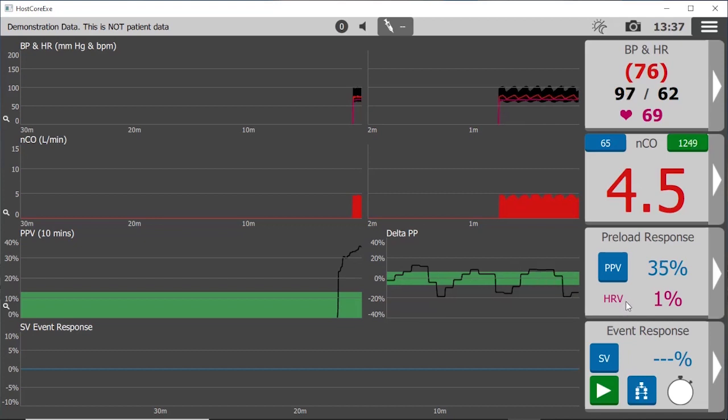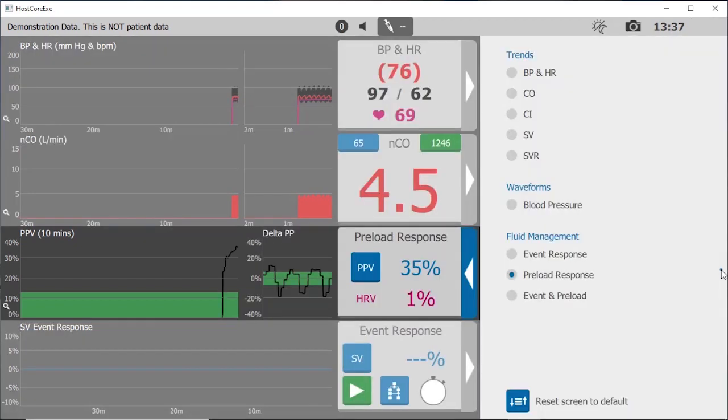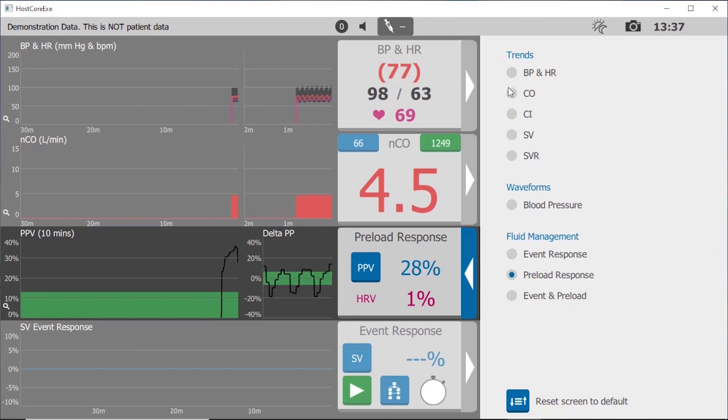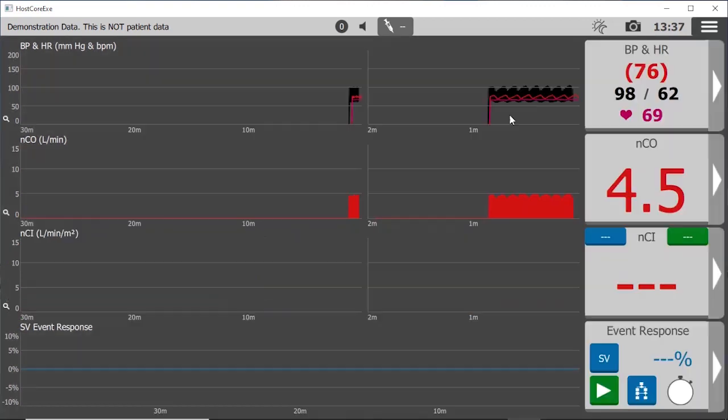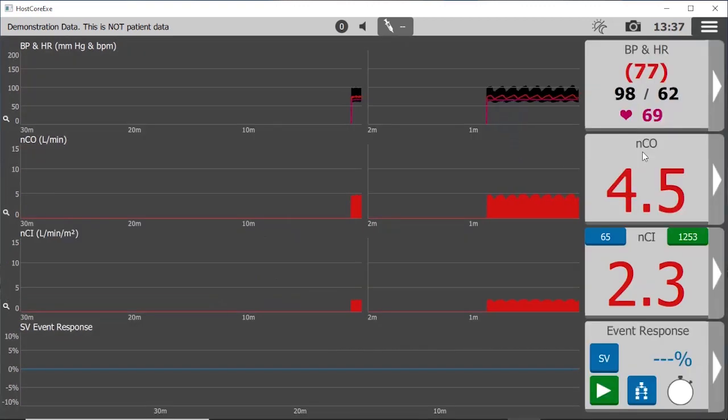Each channel also has an arrow at the right to allow display options, and here I chose to display cardiac output and cardiac index simultaneously.